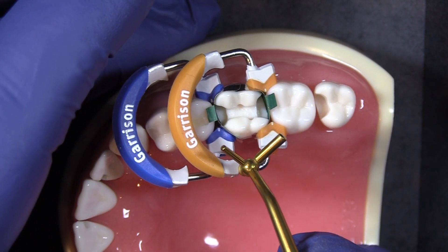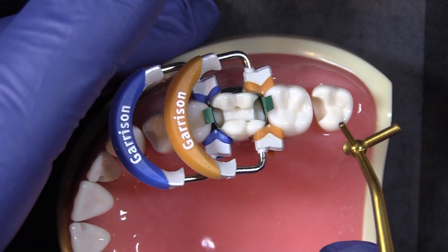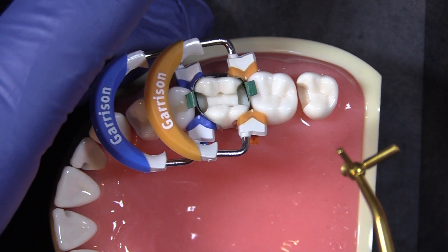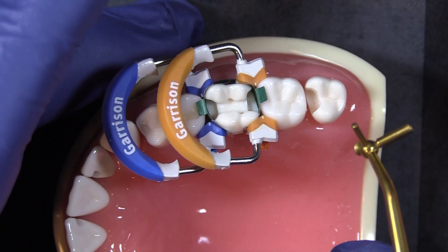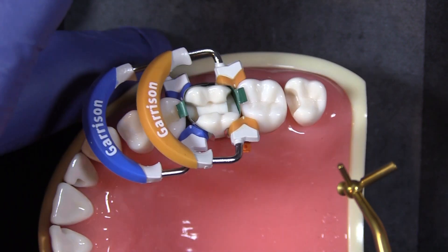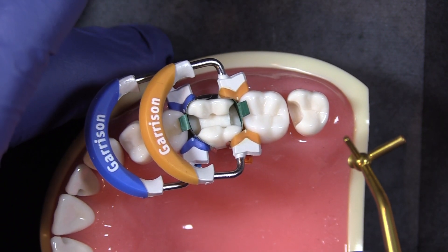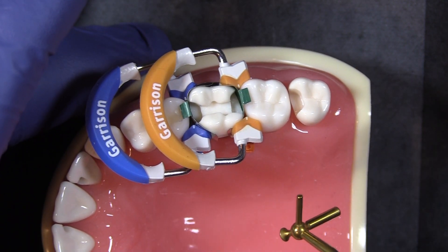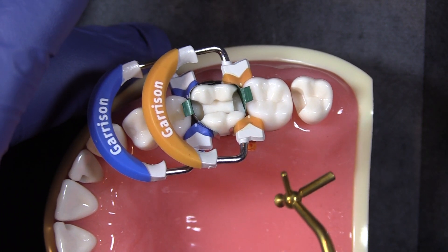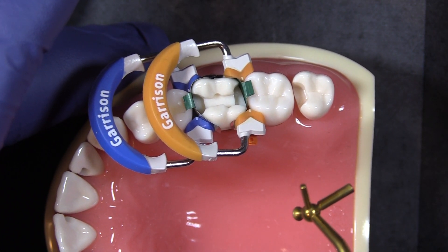This is the Garrison 3D Fusion system — it's the number one system around, and you can see what a fantastic job it does for a restoration like this, giving you all of the features without any of the drawbacks of the old-style systems. Garrison 3D Fusion — a great system, and sectionals are by far the preferred methodology for performing class twos.